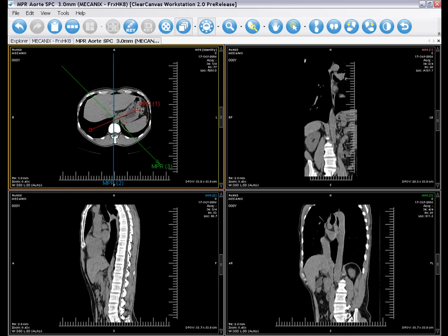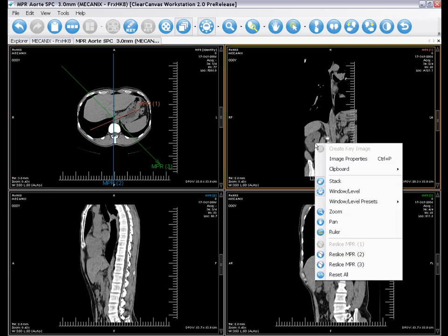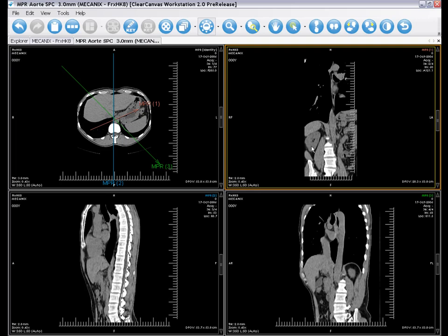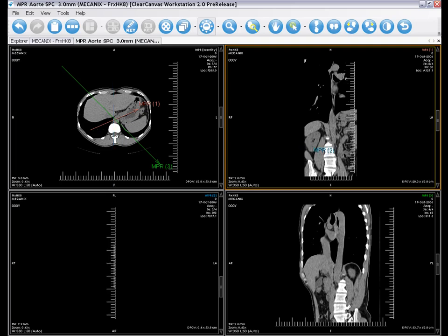It's easy to do an MPR of an MPR. Just right-click on an MPR image box, select a line from the menu, and draw the line.